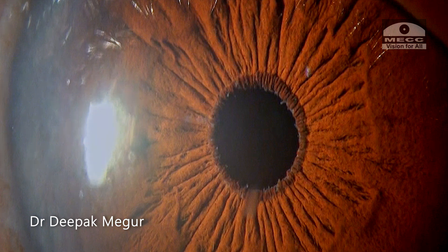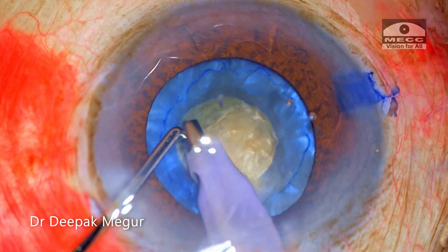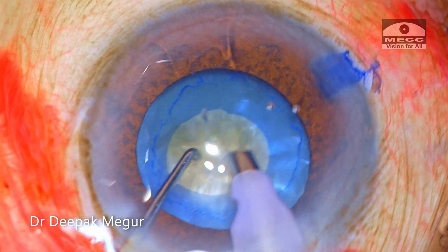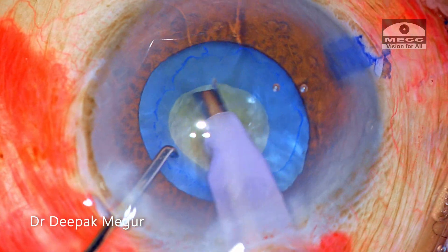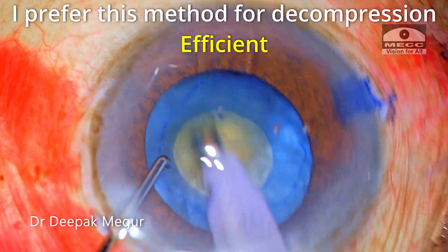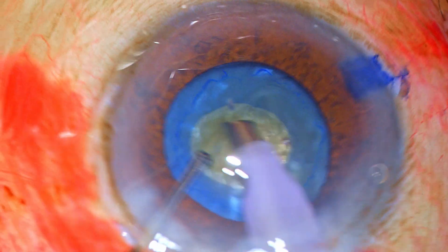To summarize: I am using this new way of decompressing the capsular bag in intumescent cataracts after performing the initial small rhexis — instead of using a bimanual irrigation-aspiration cannula or a Simcoe cannula, I am using the phaco tip to aspirate the cortex, because it is much more efficient and faster. Thank you so much for your attention and I hope this helps.